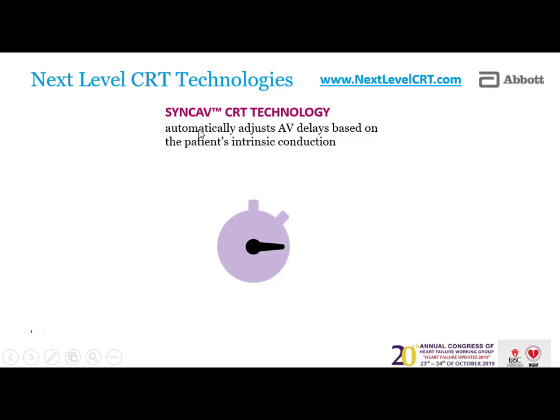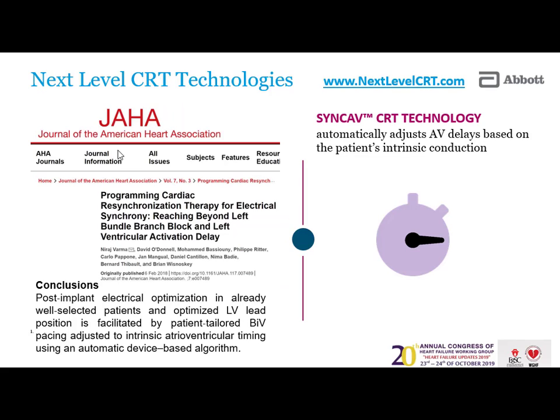The SyncAV CRT technology is the next step. Why should I pace the right ventricle? The right ventricle is the bad guy. When I pace the right ventricle, I deteriorate left ventricular function. Why not use it as a signal to give order to the left ventricle to pace before it, so I save right ventricular pacing? So comes this idea of SyncAV.